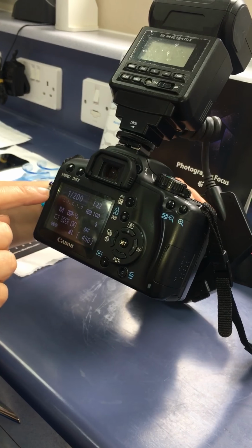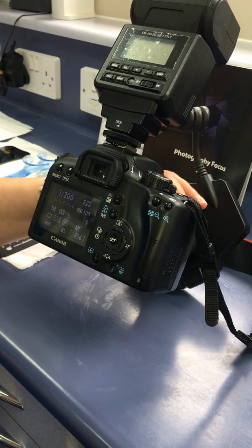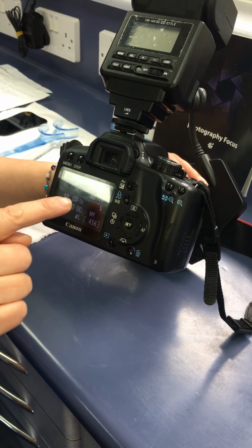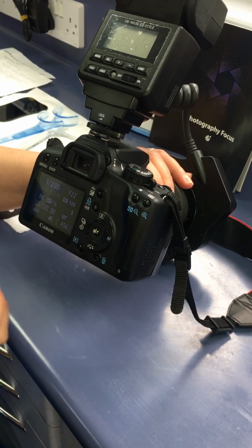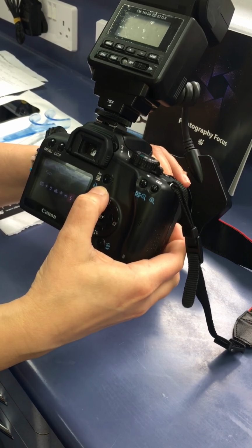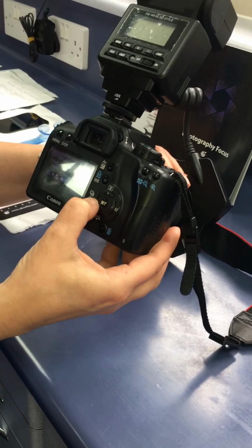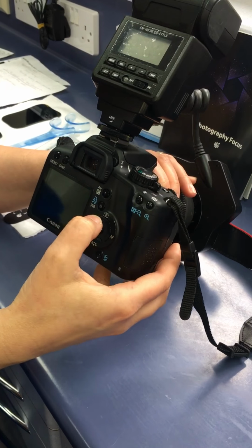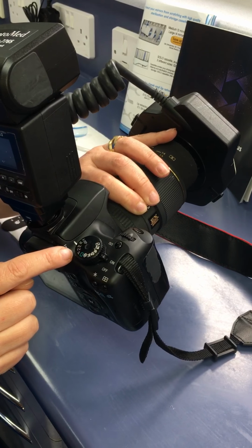Aperture size, and what does the 1 over 200 stand for? The shutter speed. For dental photography, what we need to put is F22 and 1 over 200. The white balance needs to be on flash. If I press the white balance, depending on what your camera is, you can press it back and forth, but leave it on flash. And as I said, on the knob, it needs to be on manual.